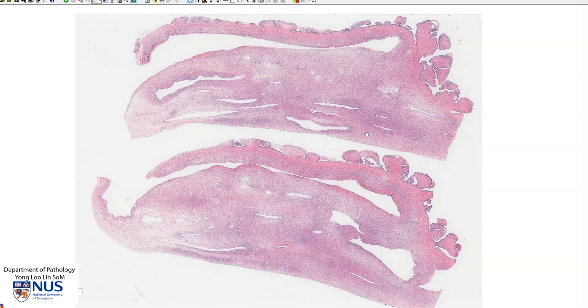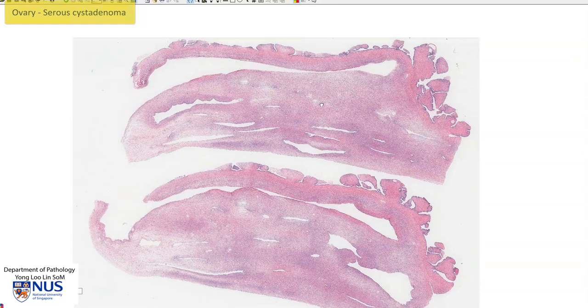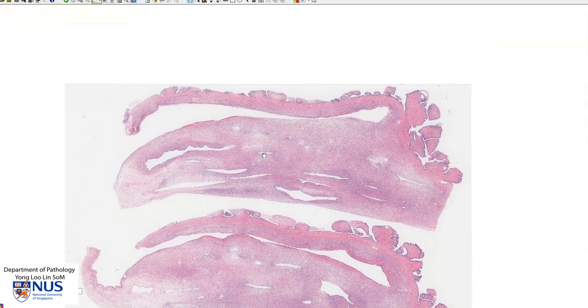Hello, this is a virtual microscopy slide of a serous cyst adenoma, a benign tumor of the ovary. This section shows two pieces and let's focus on this piece.